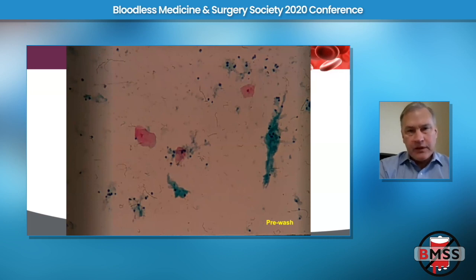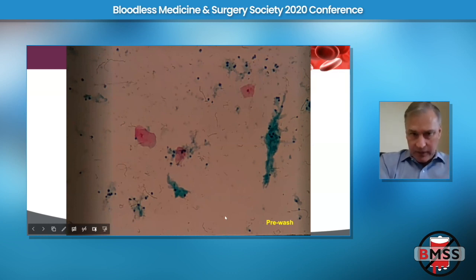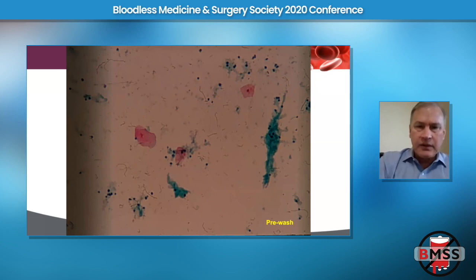So to show you the effectiveness, I have some pictures of blood that's been contaminated with amniotic fluid. And this particular slide shows you blood that had all the amniotic fluid from a particular cesarean section that was entrained into the cell salvage reservoir. And so what you see here is these red things. These are fetal squamous cells. And then you have this stuff, which my pathologist who I worked with on this study called amorphous gunk. Then these black dots are leukocytes. And then in the distant background are the red cells. This particular staining technique didn't highlight them, but you'll be able to see them in the subsequent slides because the power magnification is increased.